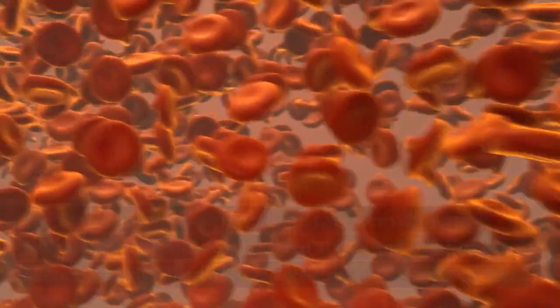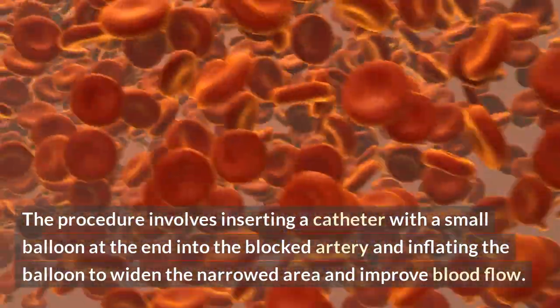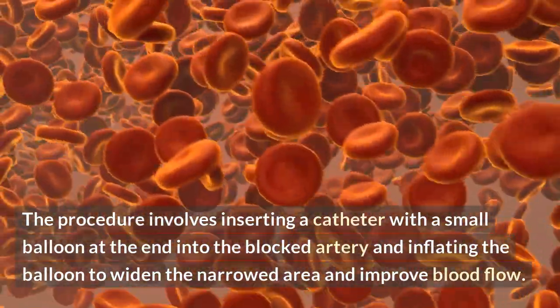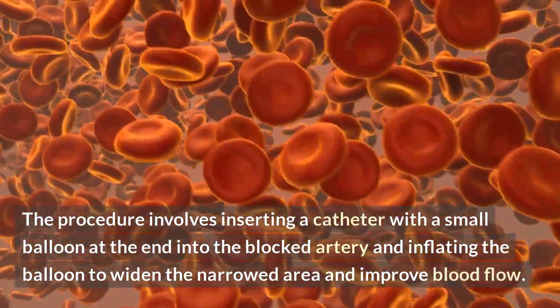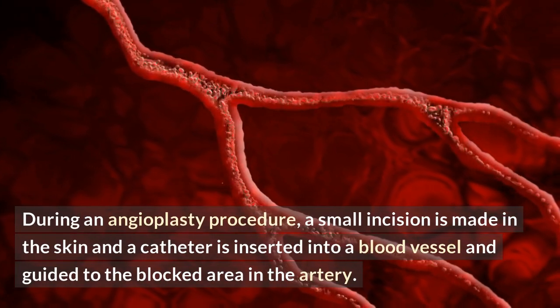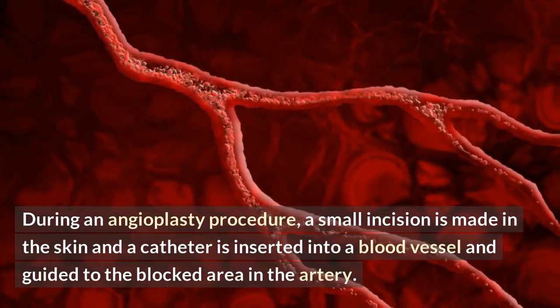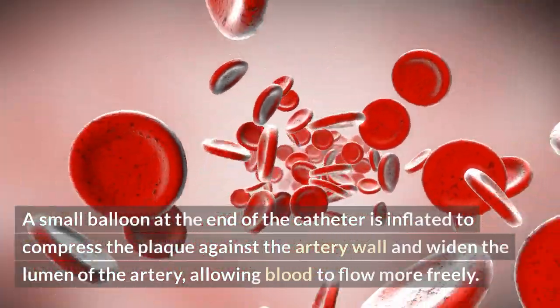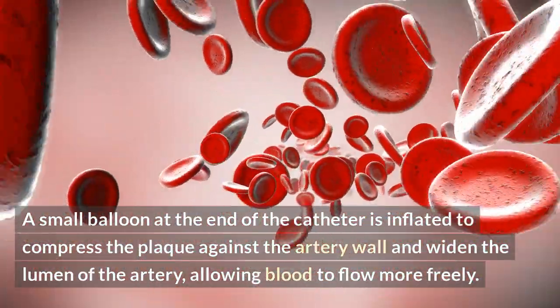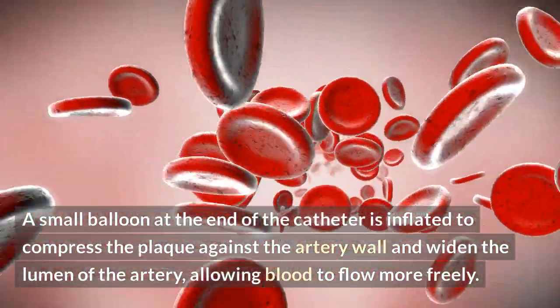arteries of the heart. The procedure involves inserting a catheter with a small balloon at the end into the blocked artery and inflating the balloon to widen the narrowed area and improve blood flow. During an angioplasty procedure, a small incision is made in the skin and a catheter is inserted into a blood vessel and guided to the blocked area in the artery. A small balloon at the end of the catheter is inflated to compress the plaque against the artery wall and widen the lumen of the artery, allowing blood to flow more freely.